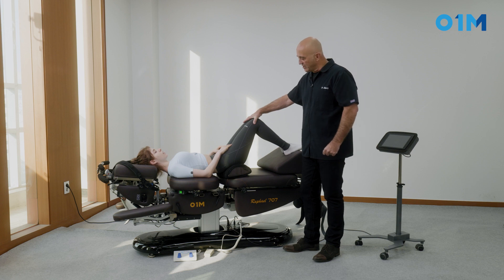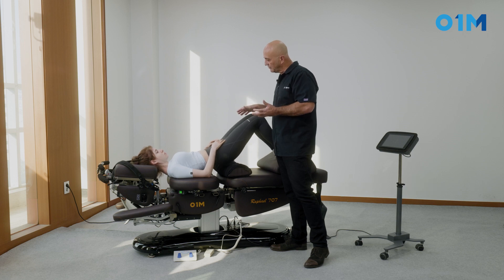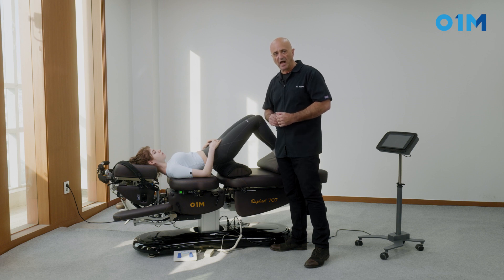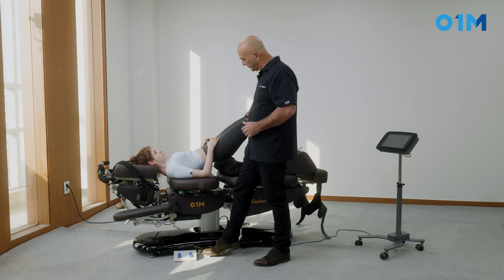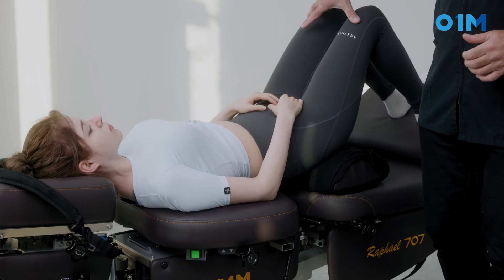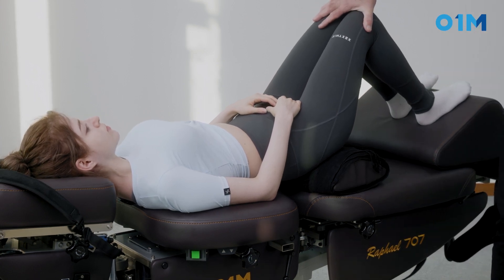What we will do is ask the patient to raise her pelvis and drop it. When she drops it, it will trigger the drop and create the corrective motion that we want. Go ahead — up, drop. We can use that protocol around 10 times.